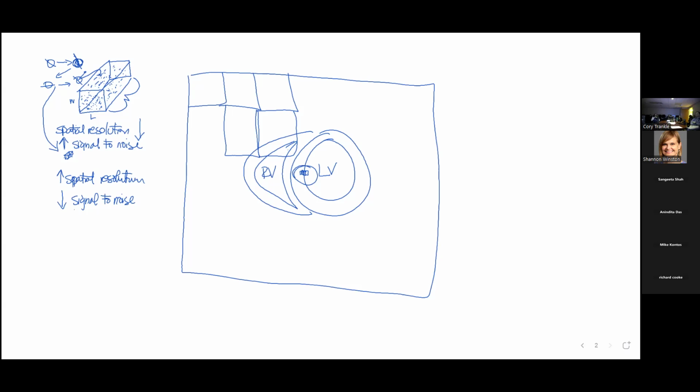There are two parameters. When you sit at the scanner, and you should sit with Shelley or Chris or Terry or whoever one day, what's kind of neat about MRI is, when you've got an echo machine and we're called in the middle of the night and you're up in the CCU and we want to know if there is a pericardial effusion or whatever, you just turn the thing on. It's going to transmit and receive. It's just doing its deal. For this technology, every time you sit down and do one single thing, you're writing a computer program.